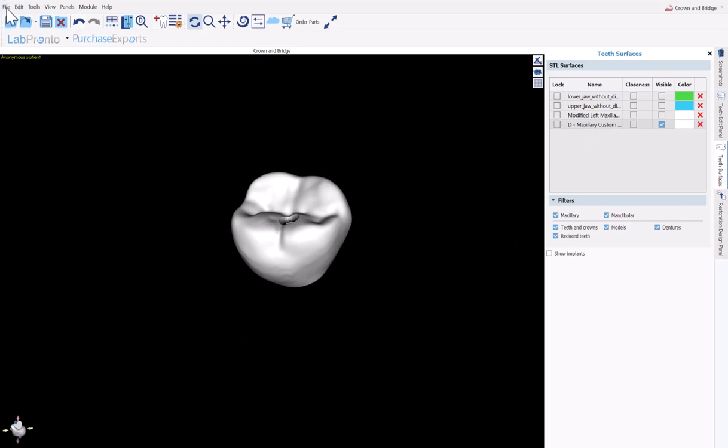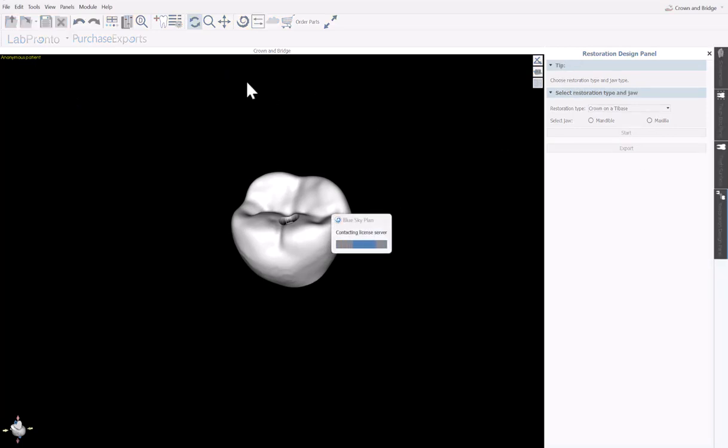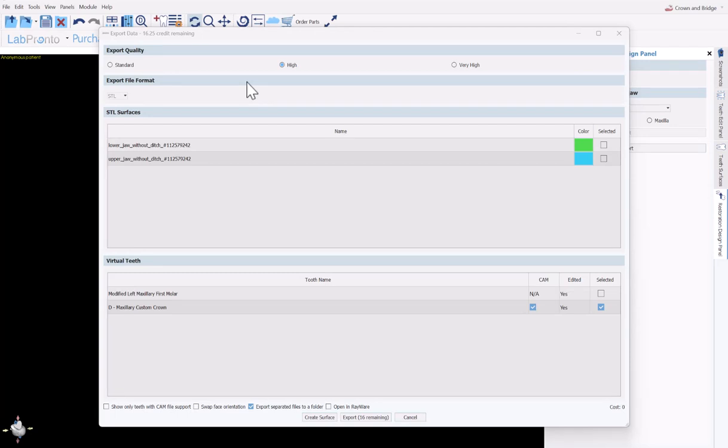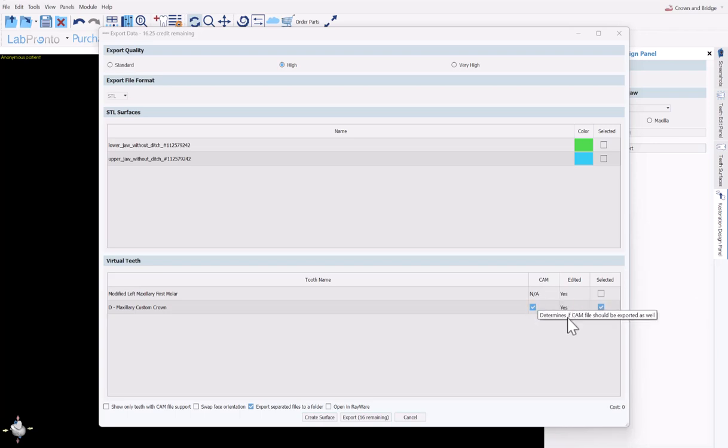We could either go to file export or we could go back to our restoration design panel and click the export button. Here we could decide for our crown that we just designed, do we want to export just the STL file or do we want to export the CAM file, the XML file for the milling machine as well. Select the relevant checkboxes, click the export button to export to the relevant files. There is no fee currently for designing and exporting crowns in the BlueSky Plan software. So you could go ahead and design as many crowns as you want on as many computers as you like, export them as STLs, as XML files, and there's no fee to be currently involved.